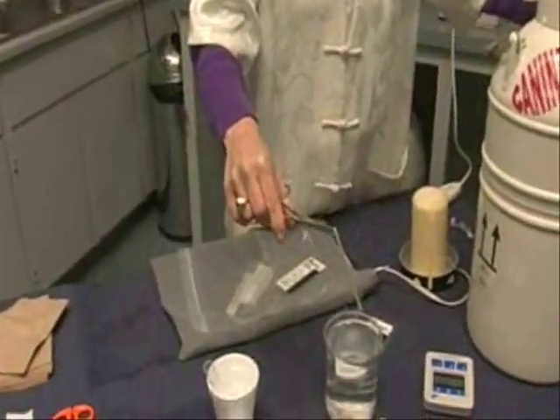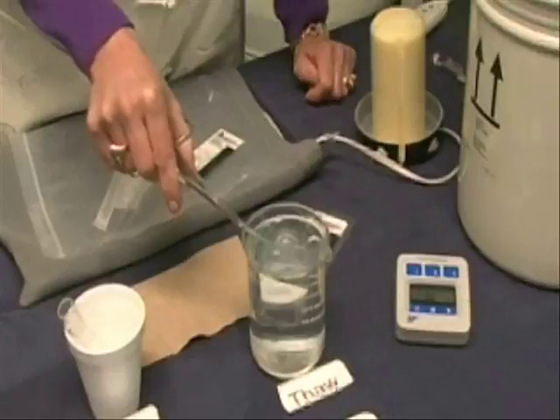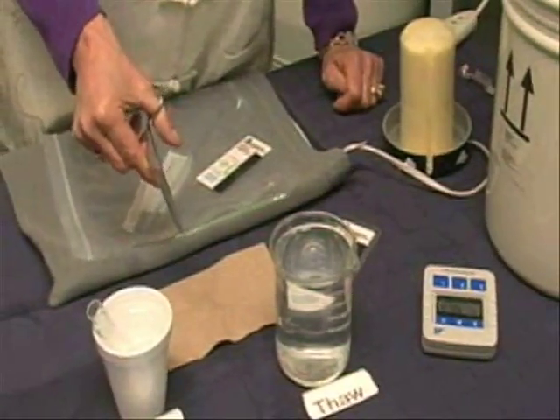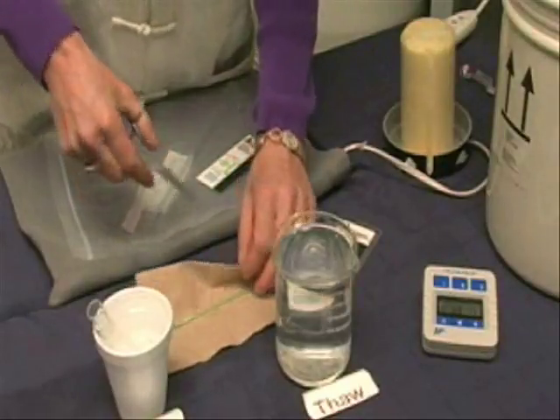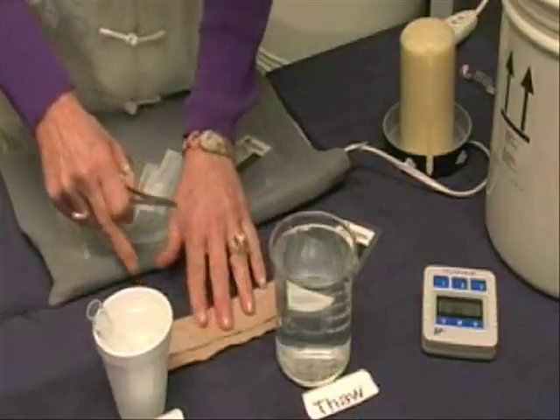Submerge in water bath. Do not let water get into the open end of the straw. Remove straw when air bubbles move freely when you invert the straw. This usually takes 10 to 15 seconds. Dry straw completely with paper towel. Prepare subsequent straws using the same manner.